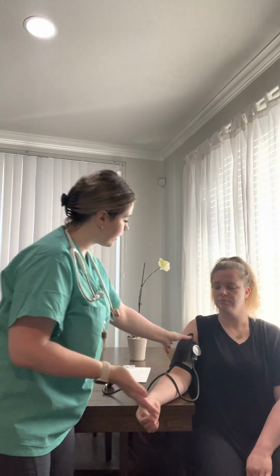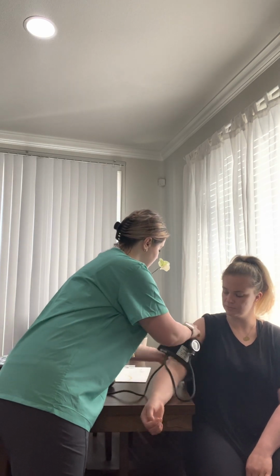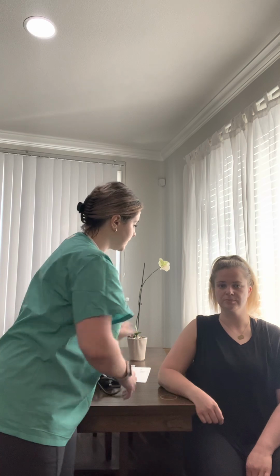Now that we have completed that, we're going to take off the cuff. We're going to place the patient's shirt back down, and we're going to ask the patient if they have any further questions. Do you have any further questions or concerns?